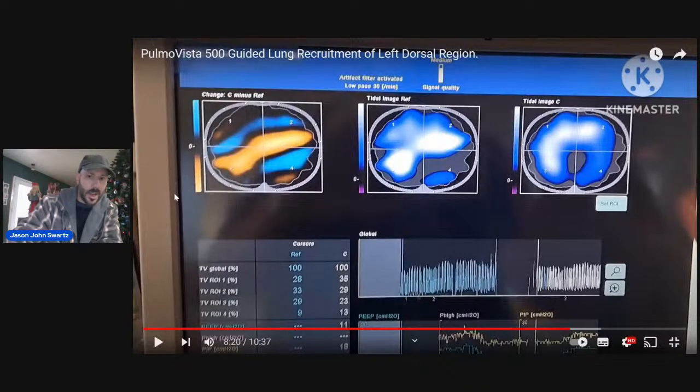Here. What happened when we opened up? Here, we gained blue, right? We gained distribution here. And where's that intense middle section of white, those two eyeballs staring at us? They're no longer there, because what's been distributed is here and up on the top too.